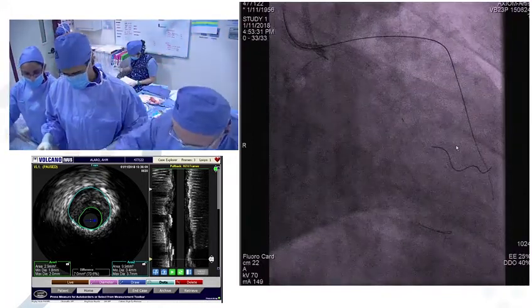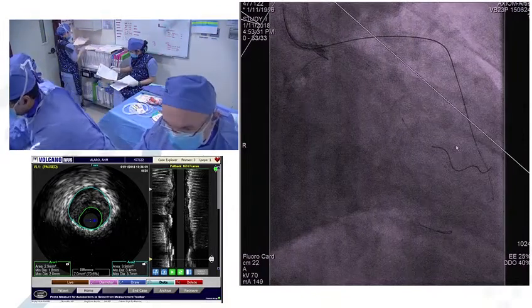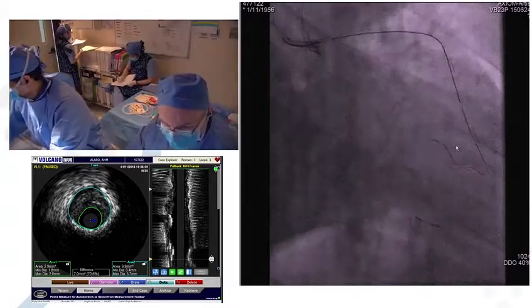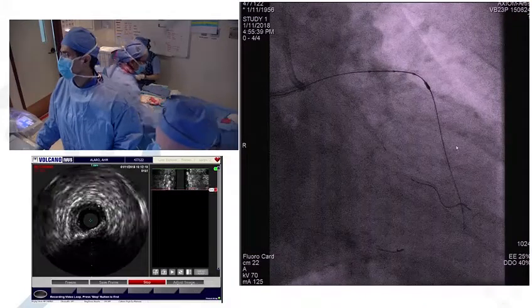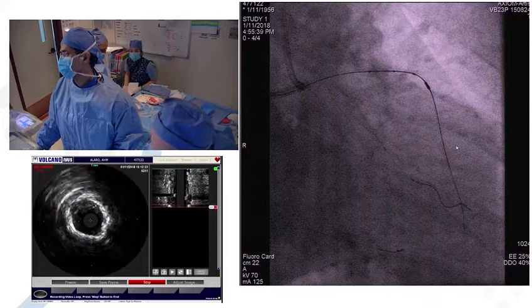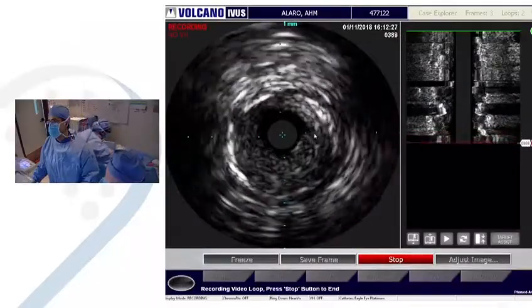Thank you. But I think it's very difficult to size. We know the proximal size, 4.0, but where do you start to taper? At this level, it's a 3 millimeter media. A lot of calcium, superficial, some negative remodeling, and now more positive.